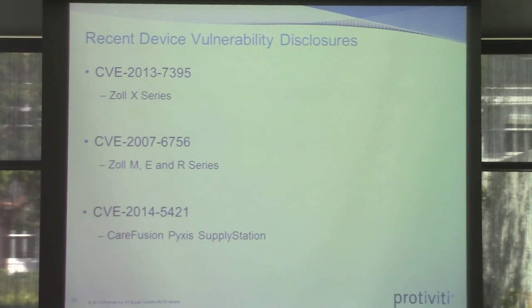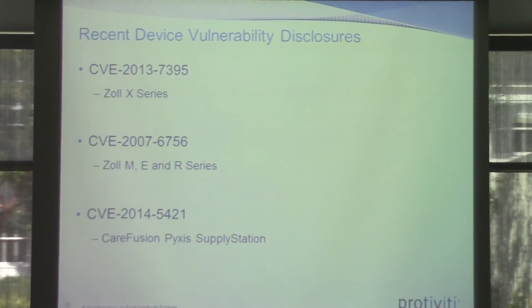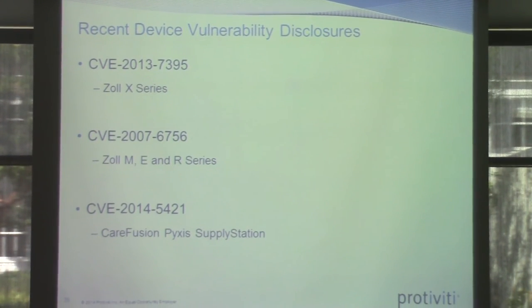And myself and Billy have both found ways where you can completely dump out all the controlled meds out of these systems. You put it into an override offline mode, like an emergency mode, and once you throw it in there, you can completely dump all the medication out of these devices. And then luckily they also have a clear event log that you can go into by design. So you go in like 8 folders deep, and there's clearevents.exe, and you run that, and it completely wipes every trace that you've been into the system, other than obviously if you're doing something at the network level or something like that, but very unlikely.